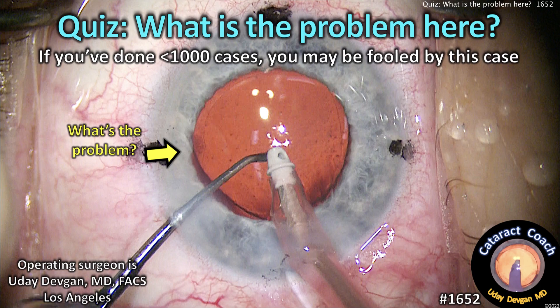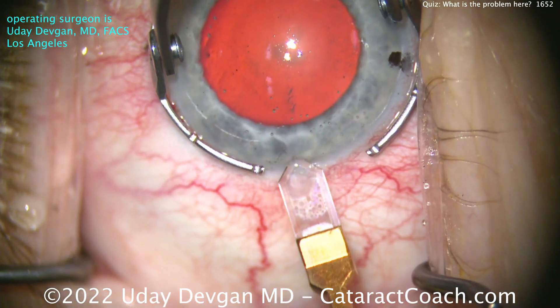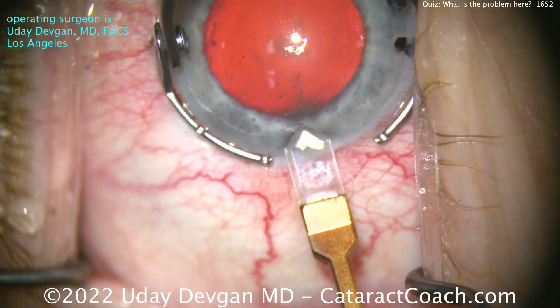cataractcoach.com quiz: what is the problem here? If you've done less than a thousand cases you may be fooled by this case. Early in my career, in my first couple of years, I may have been fooled by this case too.